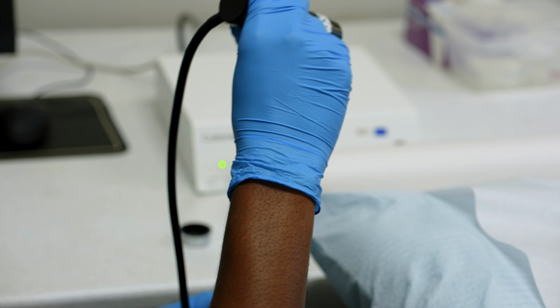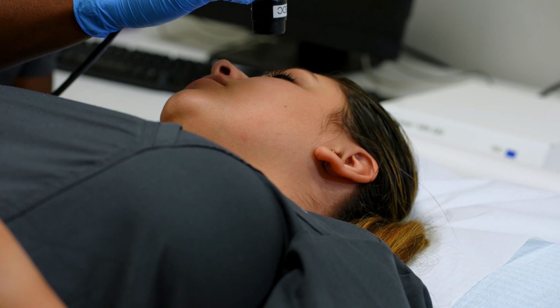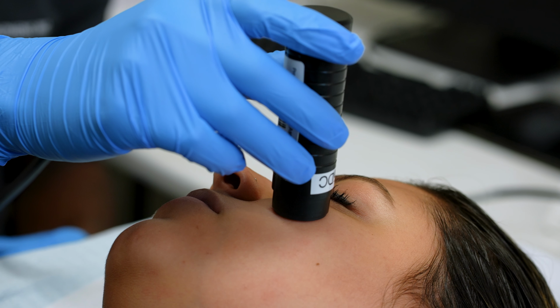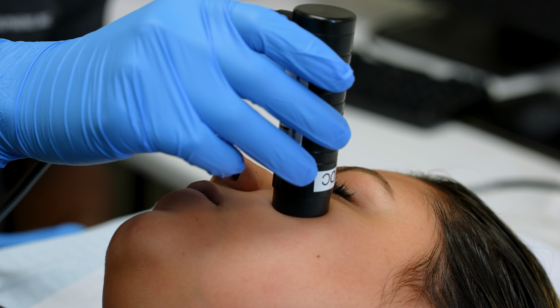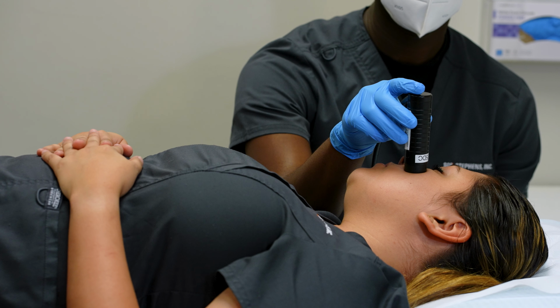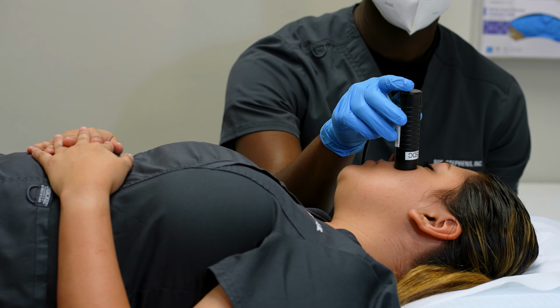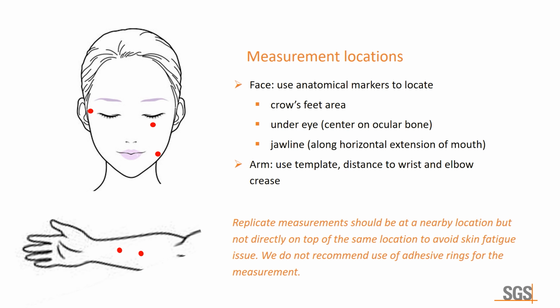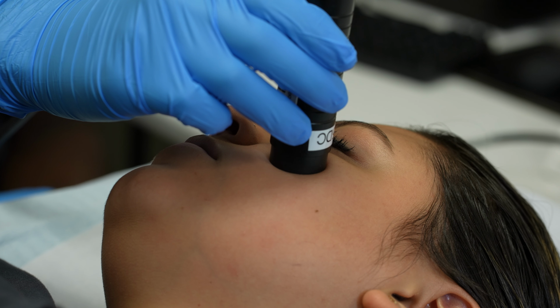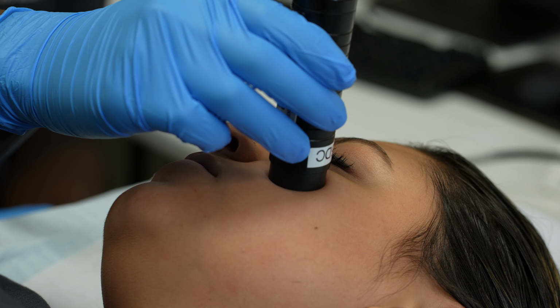Rest the probe gently on the test site so that the probe does not have any more than its own pressure pushing on it. Make sure the probe is at a 90-degree angle to the floor or as close as possible. Certain sites will not allow for this. In this case, make an attempt to hold the probe as close to perpendicular to the floor as possible while maintaining full contact with the skin.